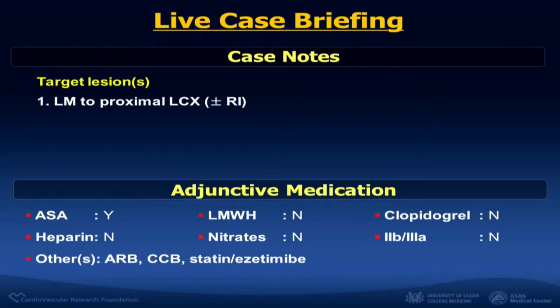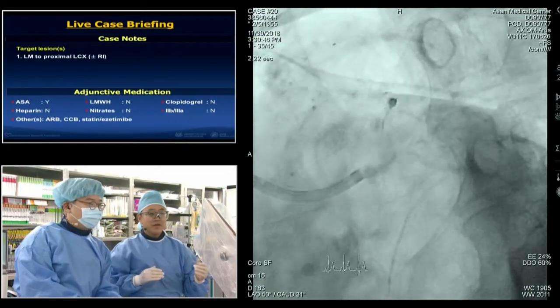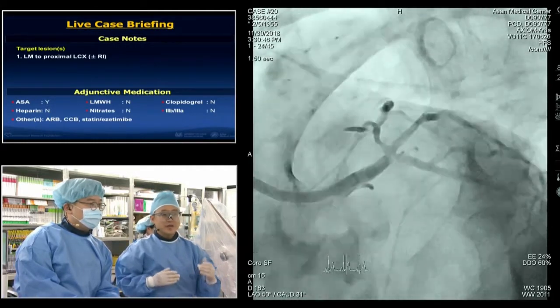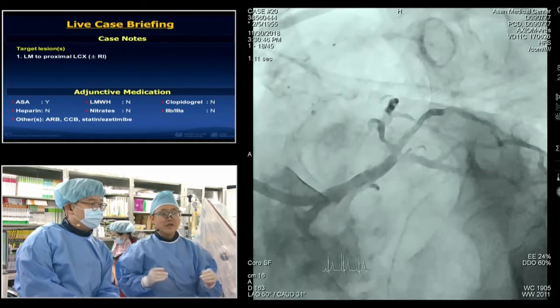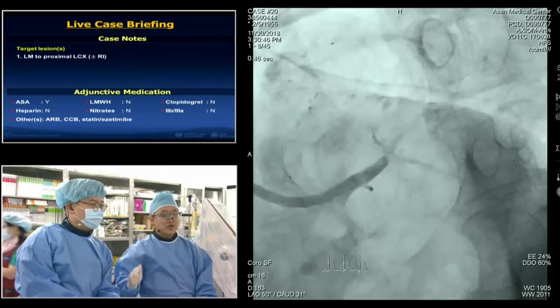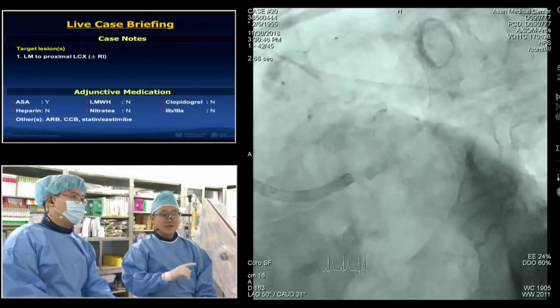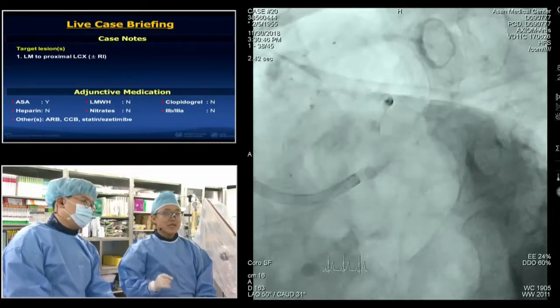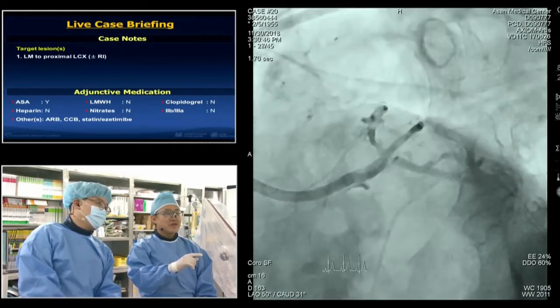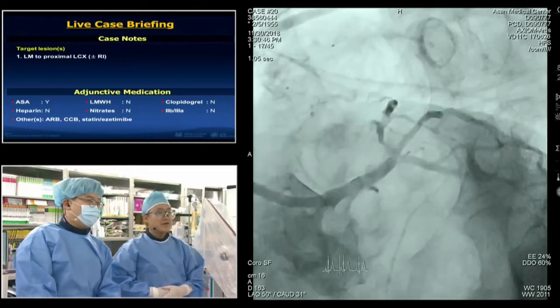Okay, if I'm going to summarize this patient's background history, he underwent bypass surgery in 2009, nearly 10 years ago, and sometimes the patient complained of upper chest pain, and we checked the Thallium scan. The Thallium scan showed a large perfusion defect in the anterolateral, circumflex territory area. And we checked the coronary angio: LIMA to LAD is patent, and this is a protected PCI. And looking at the spider view, there was a circumflex region. What is the first view? Baseline, the angio, the caudal view.